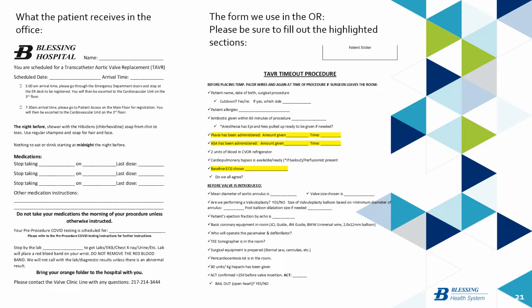I try to come early that morning and fill out the annulus size and all of that. If for some reason it's not filled out and I'm not here, you could always get a hold of myself or Diana Weatherford, and we could tell you what those sizes are. Everything is scanned in, so some of those sizes come from the Medtronic or the Edwards report that gets scanned in to the outside documents. But we'll have the rest of that.